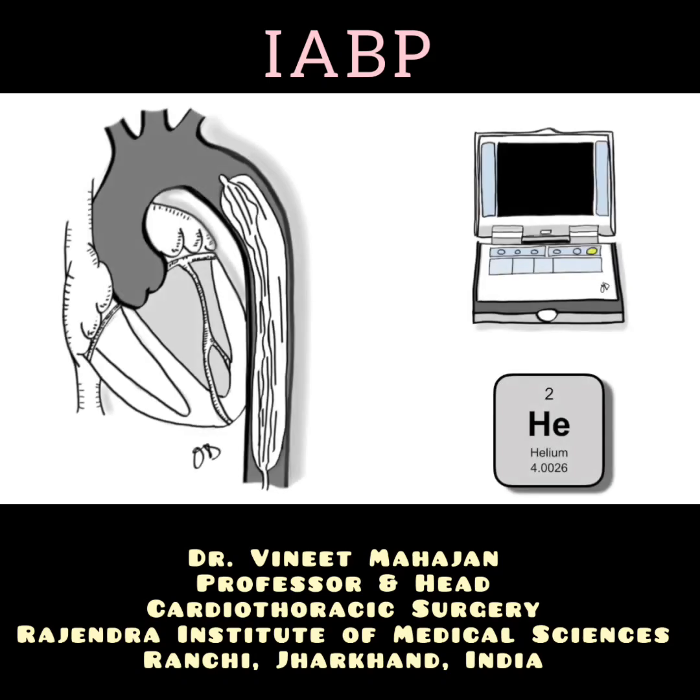The intra-aortic balloon pump is a mechanical circulatory assist device used to support the left ventricle. Counterpulsation refers to balloon inflation during diastole and deflation during systole. Thus, the intra-aortic balloon pump is timed to the native cardiac cycle. The brains of the intra-aortic balloon pump is the console.